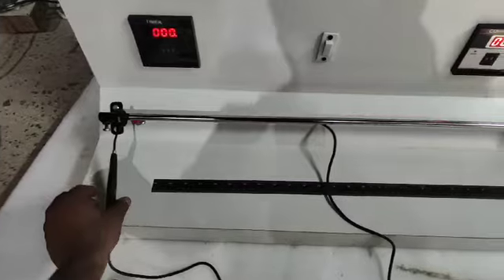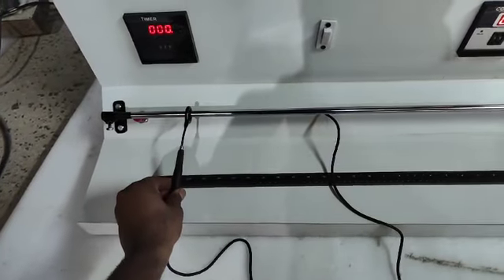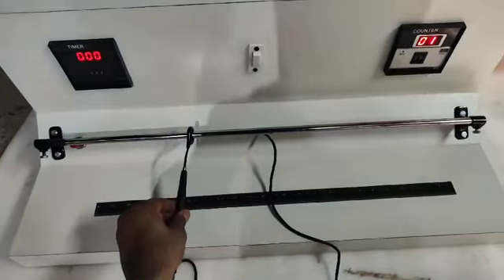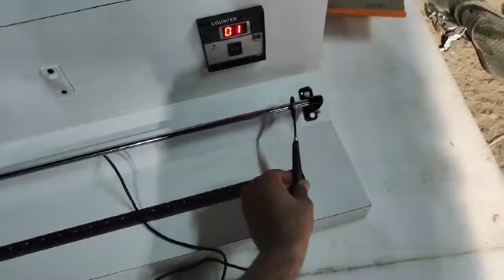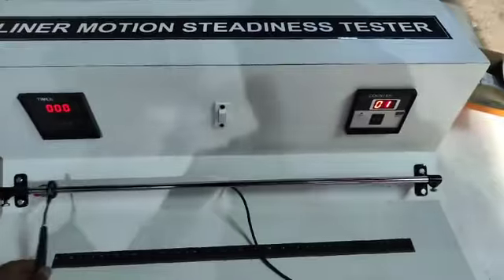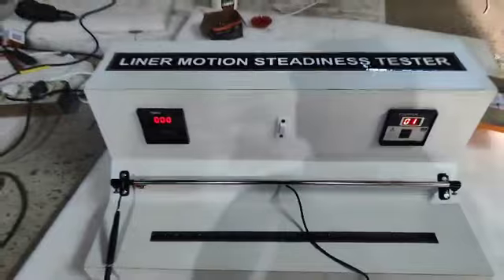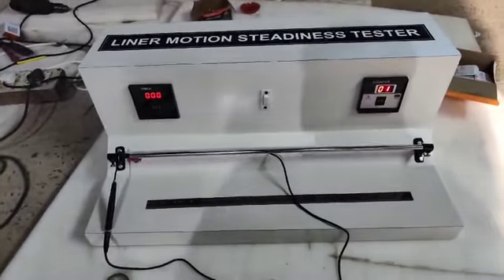Your task is to rotate this handle without touching the rod. When you touch it you will get an alarm. The number of repetitions you complete will be counted here in the counter, and the task of the patient is to complete this without touching the rod.